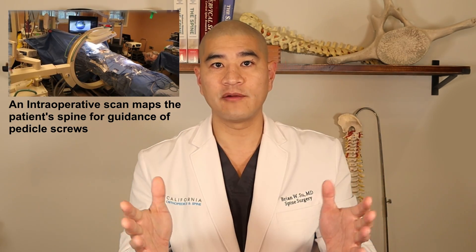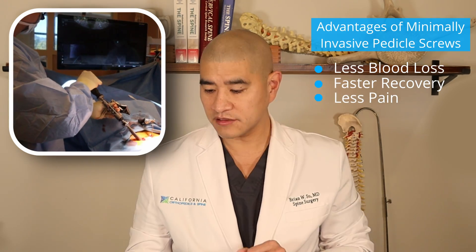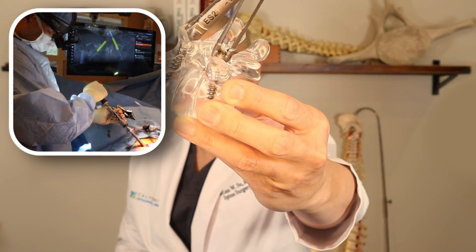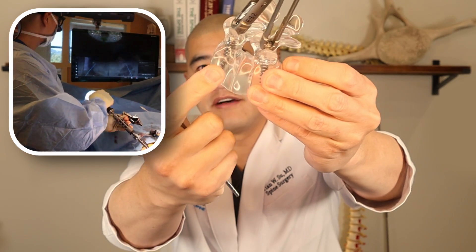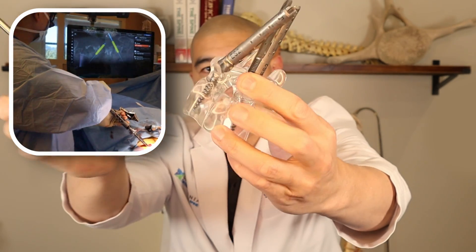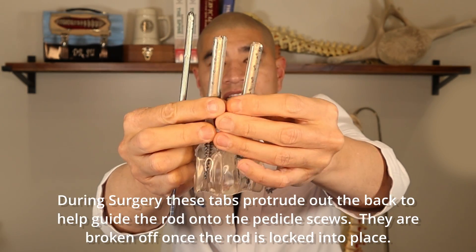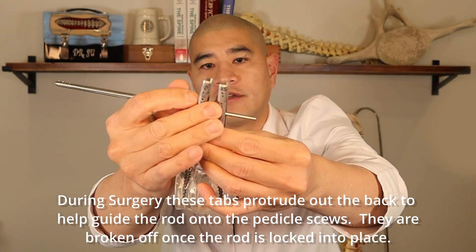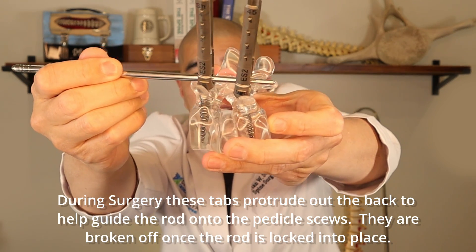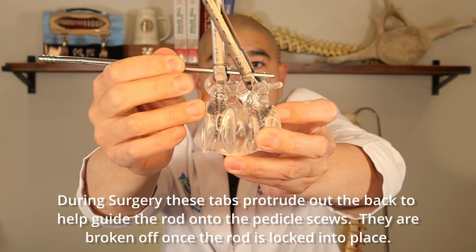To do this minimally invasively, we use fancy intraoperative image guidance to guide the screws because we're not opening the entire spine — just working through two smaller incisions. Two small incisions obviously leads to less blood loss, faster recovery, and less pain. For example, here you can see an L4 screw and an L5 screw with tabs, which are used to guide a rod from top down and lock it to the screws in order to provide stability between the two segments.